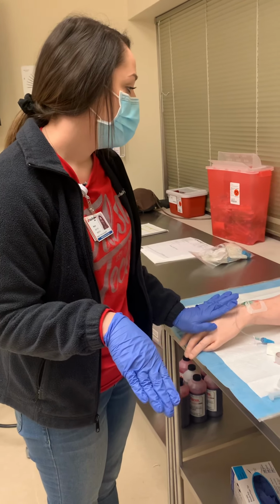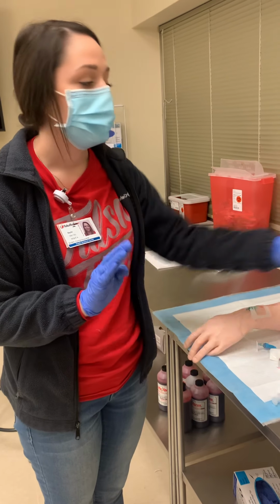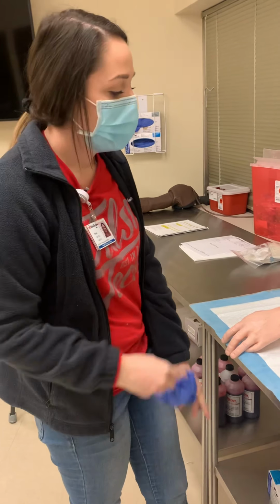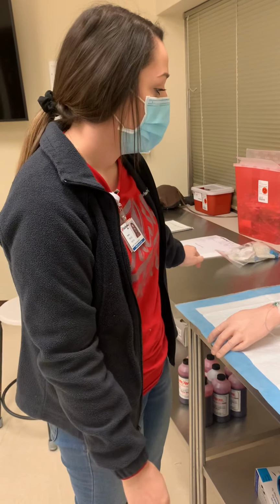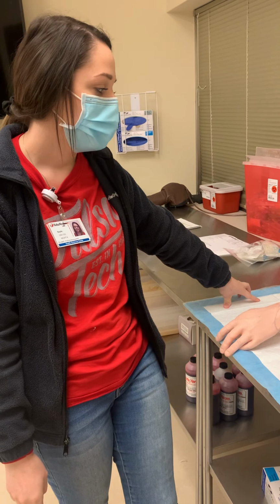Is there anything else I can do for you today? Thank you for letting me take care of you today. I would dispose of my supplies, wash my hands, and document insertion site, time, type of catheter, number of attempts, flushes used, and patient teaching.